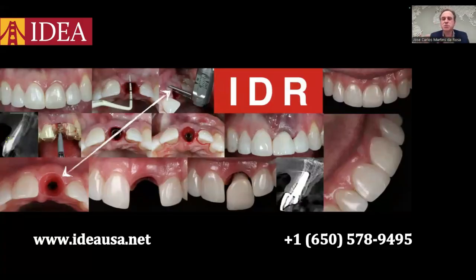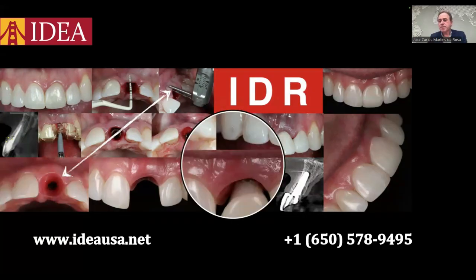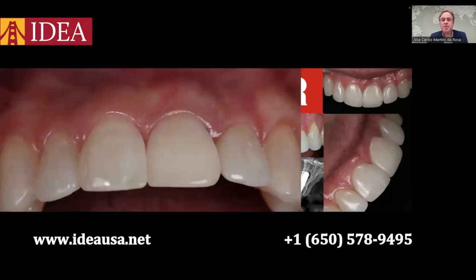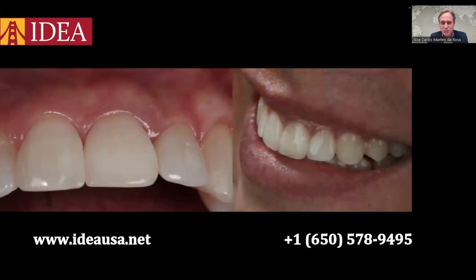That's the main difference between the IDR technique and the other techniques available in the literature. After 3 months, we did the scanning and delivered the final restoration with ideal emergence profile. And now you can see the outcome, the final crown in place. Now you can see the follow-up after 2 years and the maintenance of the volume of soft tissue around this final restoration. And you can see the balance between the lips, the gingival architecture, and the final restoration.